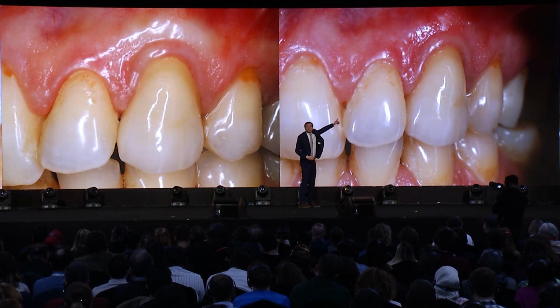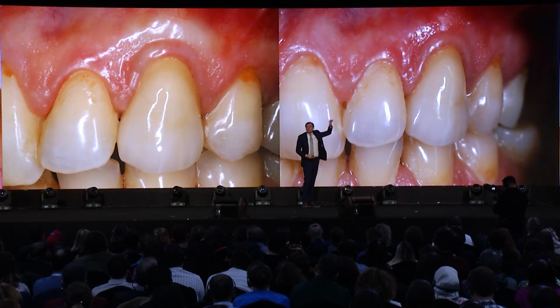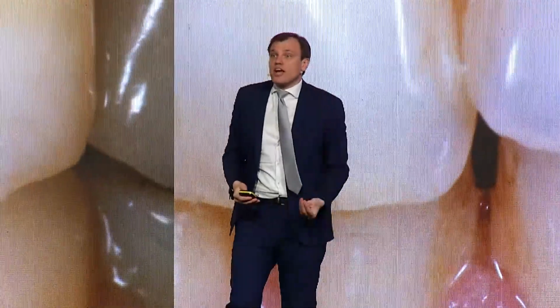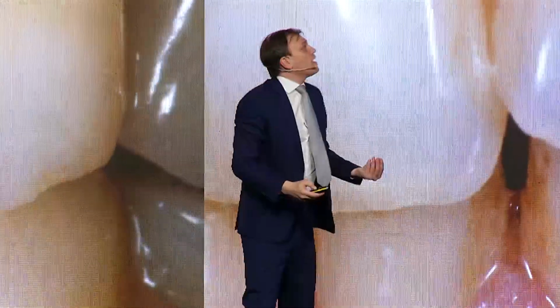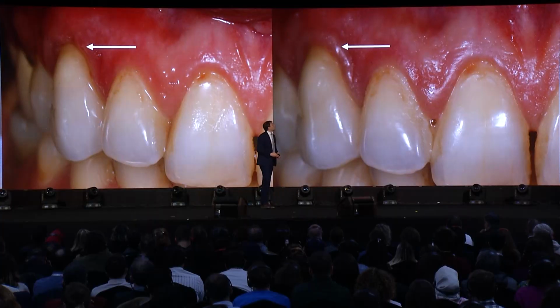Take a look at the patient hygiene. Doesn't clean teeth, but it doesn't affect. Remember that zirconia is the least plaque attractive material, especially when you compare at the delivery and 5 years follow-up.